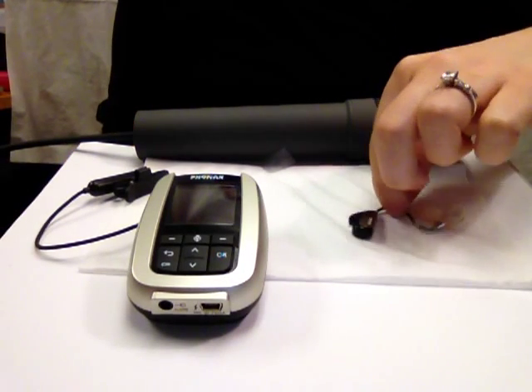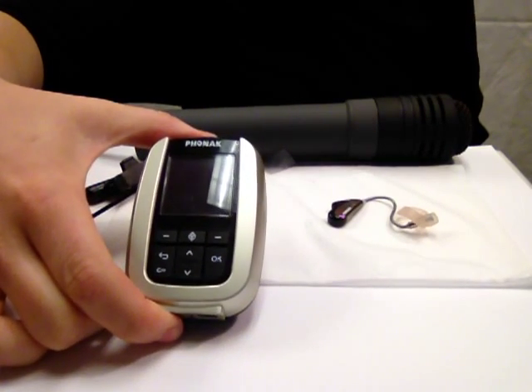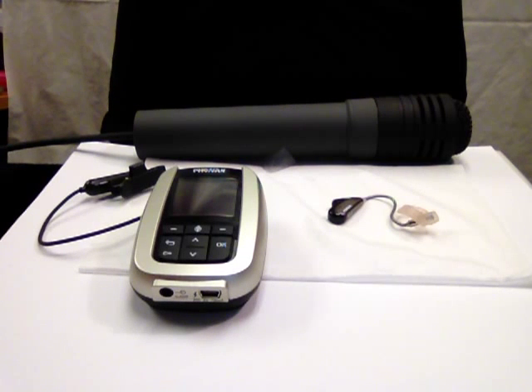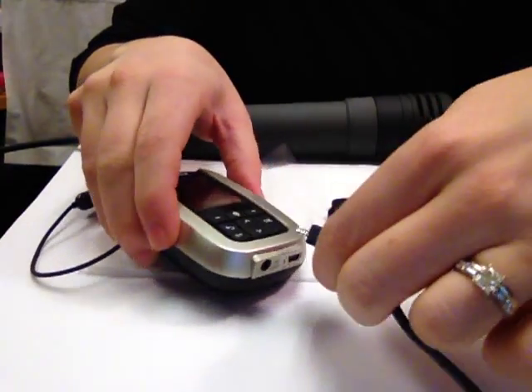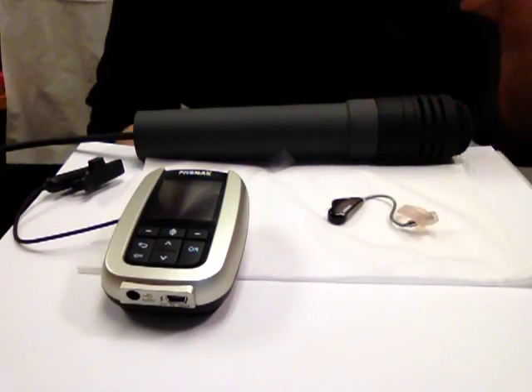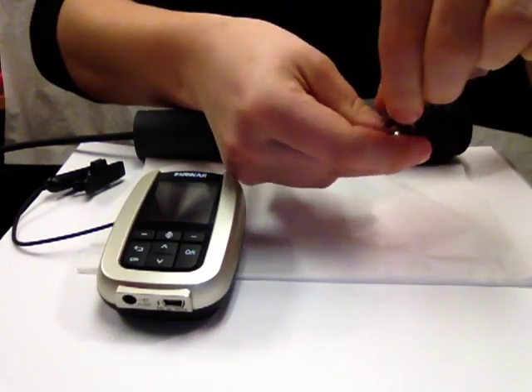This is the iSense receiver, and this is the Inspiro transmitter. Now what you'll need to do is pick a responsible person to check the iSense functioning each morning. To do this, disconnect the charging cord from the Inspiro transmitter. Check the battery in the iSense receiver with a battery checker if one has been provided to you.